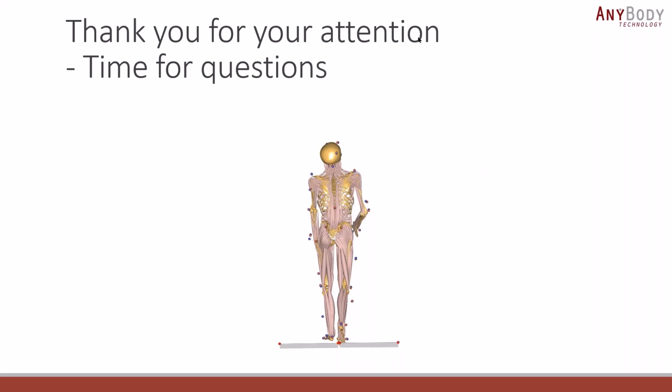it is also important to acknowledge the limitations of this work. So we utilized only one implant type, a cruciate retaining prosthesis. So we didn't see any other types of implants. For instance, a medial pivot could be a prosthesis according to the literature that could facilitate reproduction of the pre-diseased, the healthy situation, but we didn't look at it.